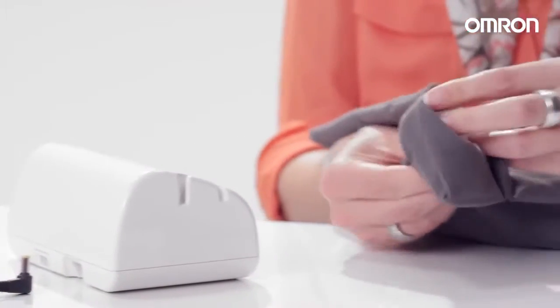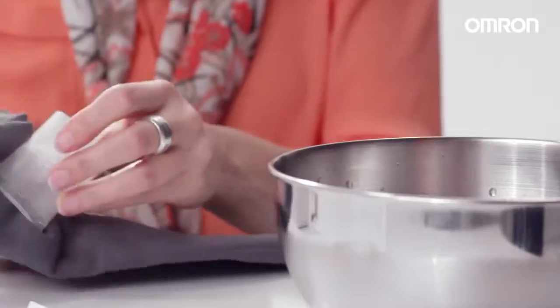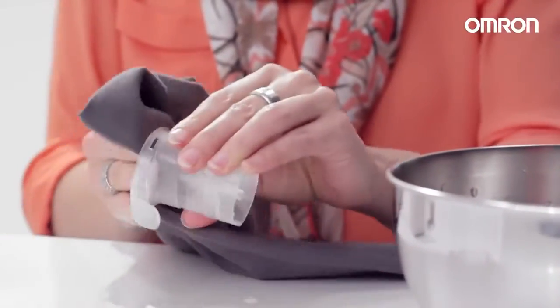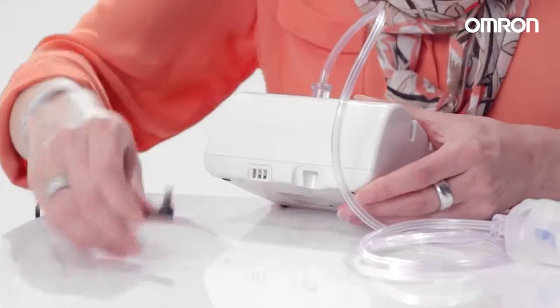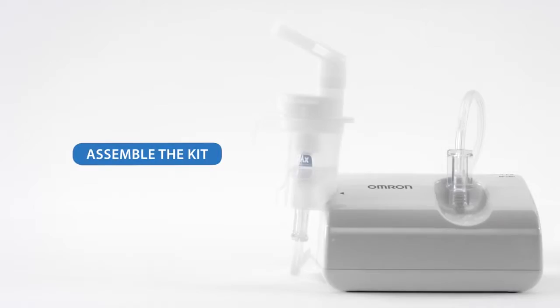Clean and disinfect the nebulizer kit and all accessories with warm water before initial use or if not used for a long time. Insert the power plug of the AC adapter into the compressor and into a power outlet. Now assemble the nebulizer kit.